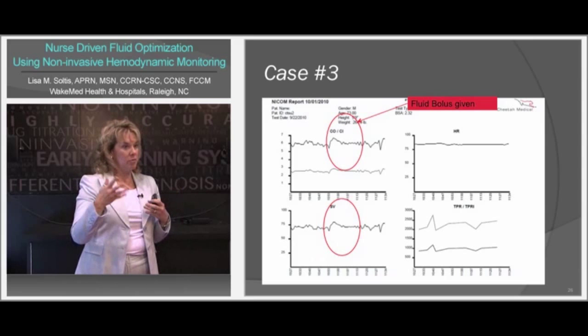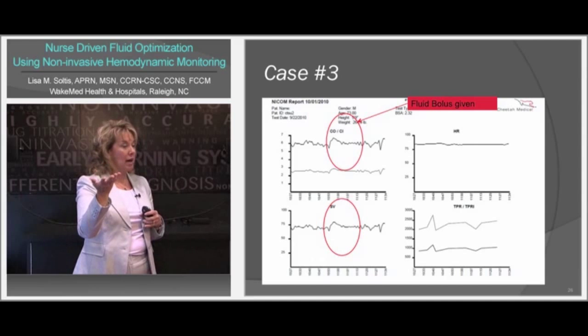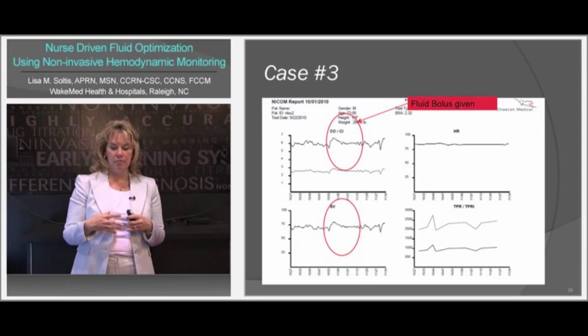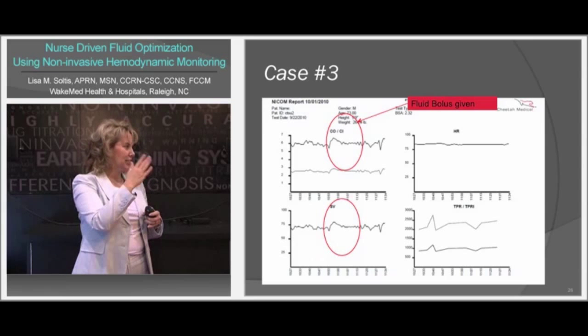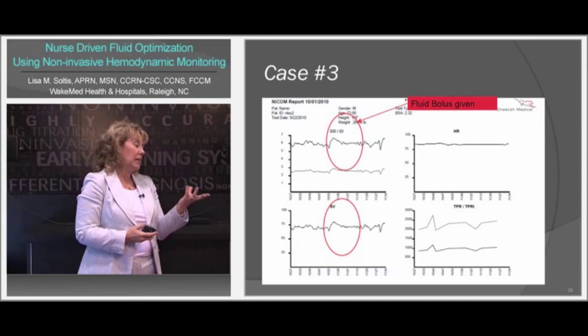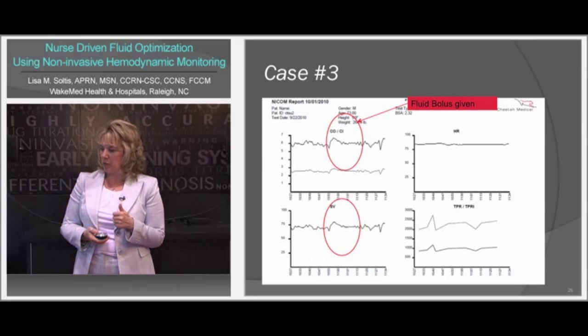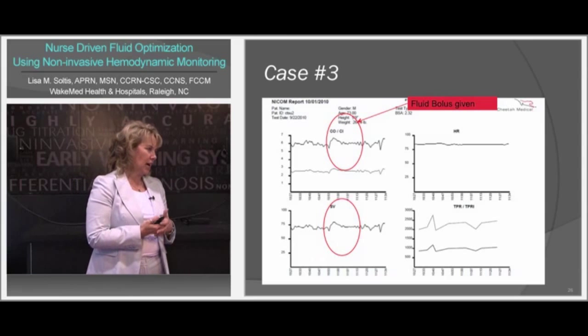We did see the PA catheter mimic that same trend, but it took about 3 minutes to actually catch up. But we saw it almost immediately when we had them on the NICOM itself. So again, when we gave that fluid bolus, we saw them improve significantly.